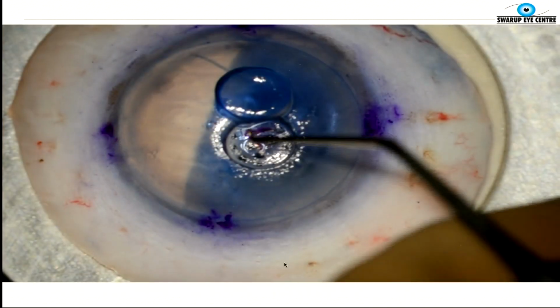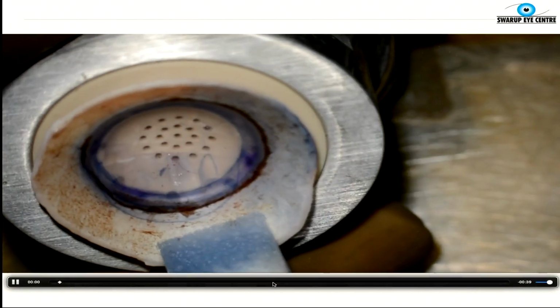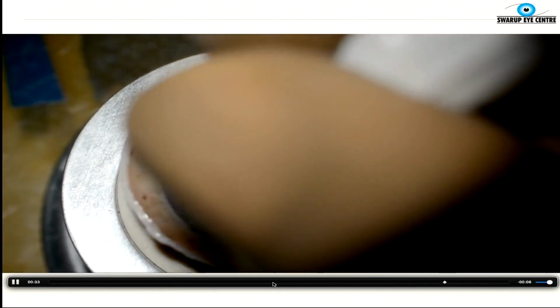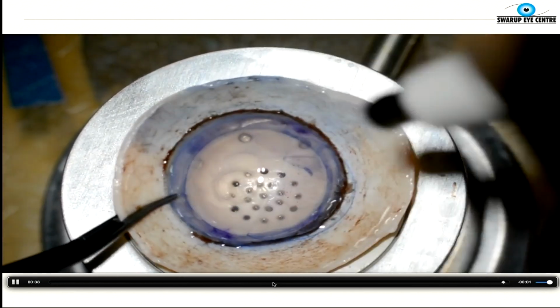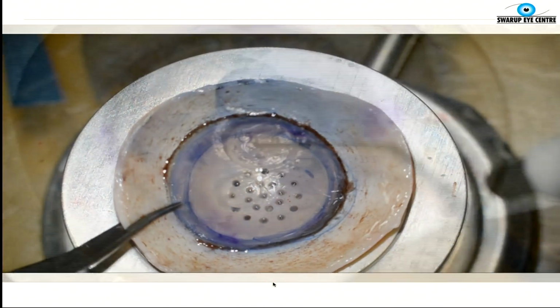So after you've stained the stripped area, you make a punch in the area where the Descemet's membrane has been stripped off. And this is a small 3 millimeters or 2 millimeters window. You can use your keratoprosthesis trephine, or a dermal punch to create this little circular opening. And that basically helps you to get a window to mark the anterior surface like so.